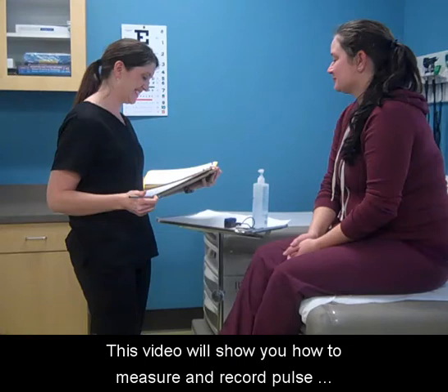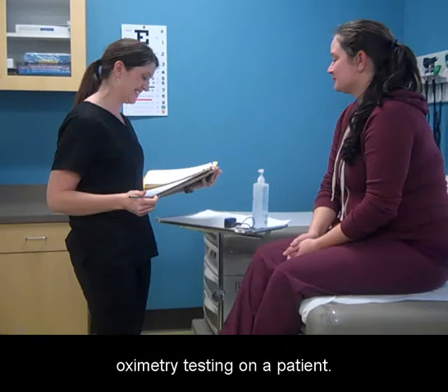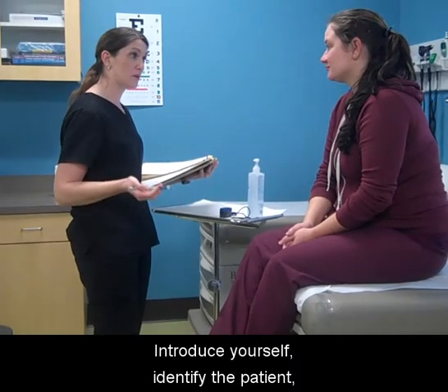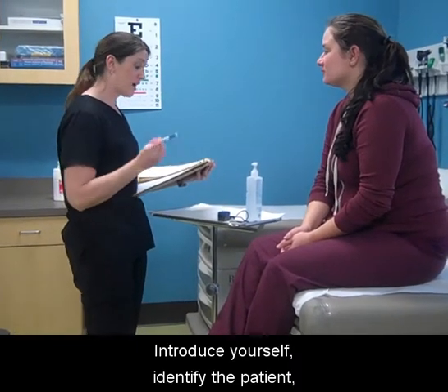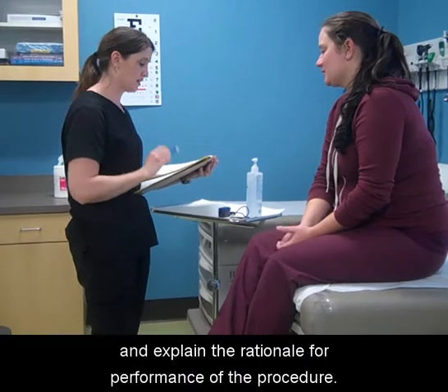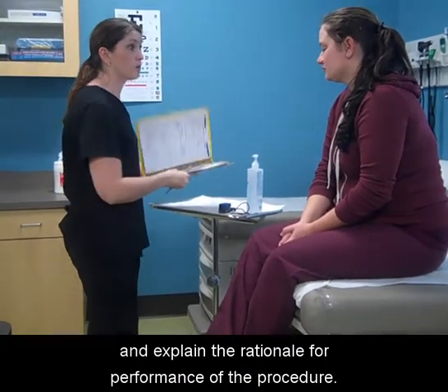This video will show you how to measure and record pulse oximetry testing on a patient. Introduce yourself, identify the patient, and explain the rationale for performance of the procedure.